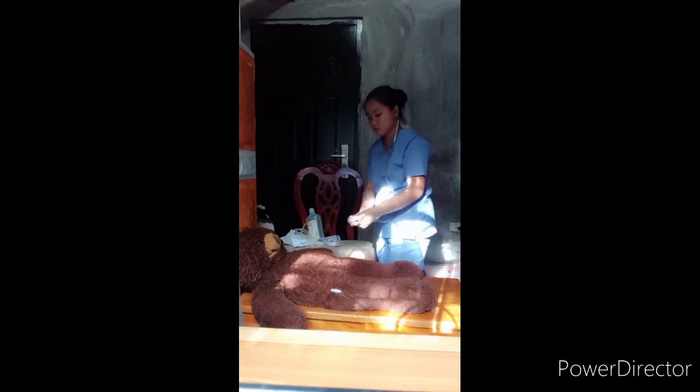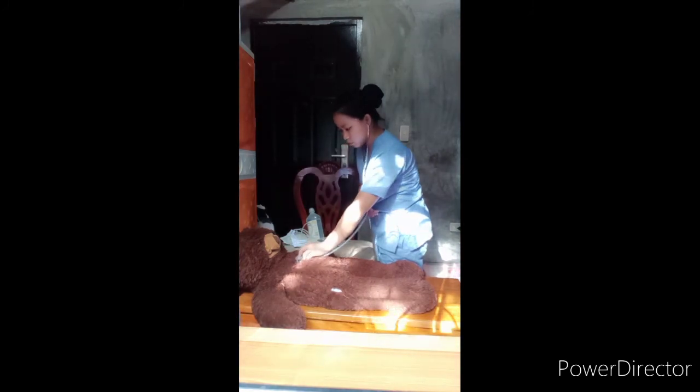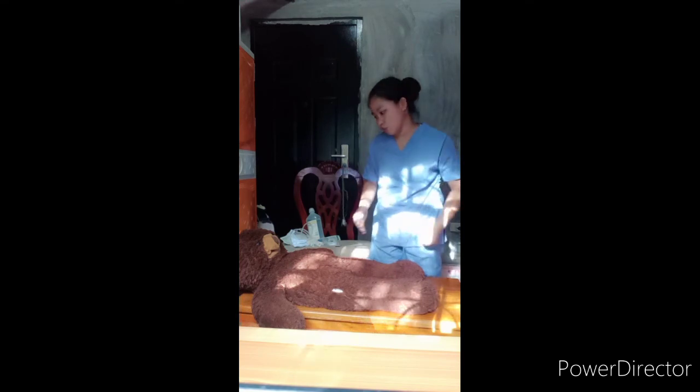So, ma'am, could you give me a thumbs up if the breathing is easier? Okay, thumbs up. And then next is let's ask the patient if breathing was easier. So, after that, let's auscultate the lungs and compare the patient's respiratory assessment before and after suctioning. And then next is let's observe the character of the airway secretions.